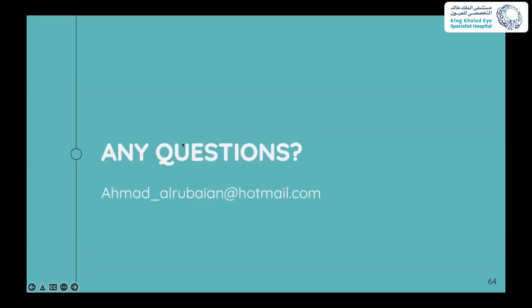And this is another question: how can we deal with aberrations? The newer machines tend to induce less compared to the old machines. This is what I know. And most of the time, if the patient already has aberrations, they might be worse after the procedure. So this is why we tend to look at these patients and customize their treatment based on their preoperative wavefront aberrations. So this is why we actually take care of these aberrations.